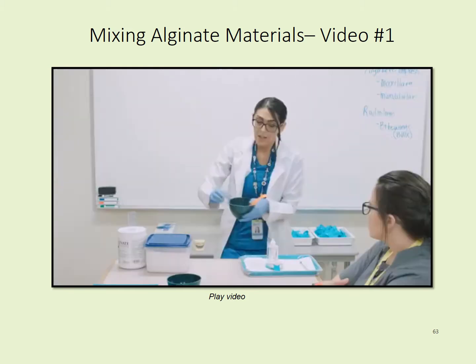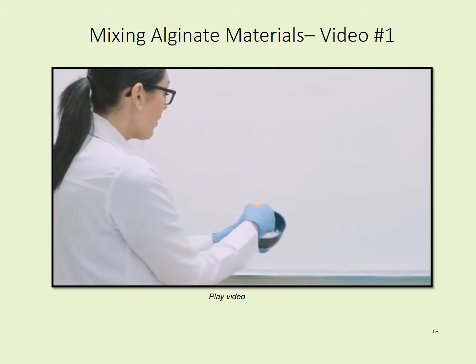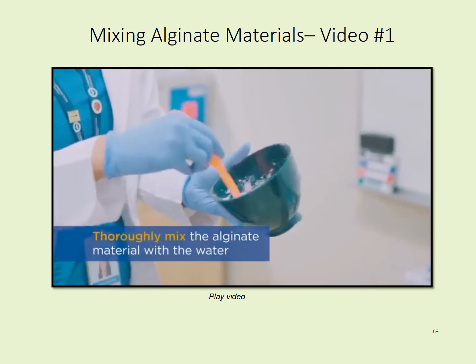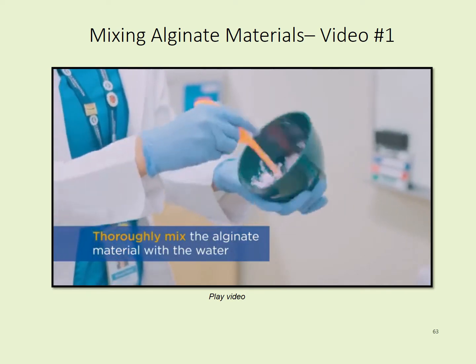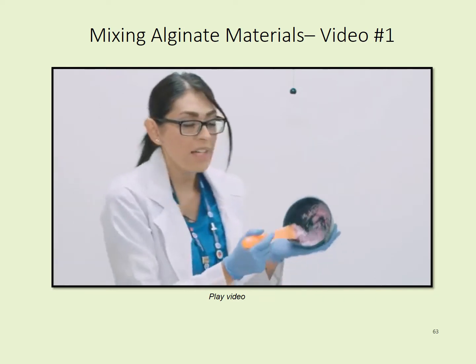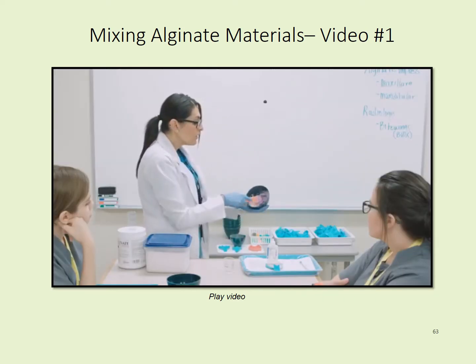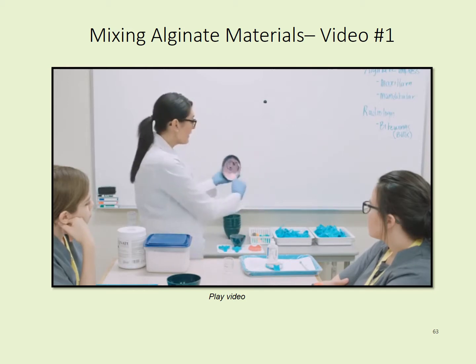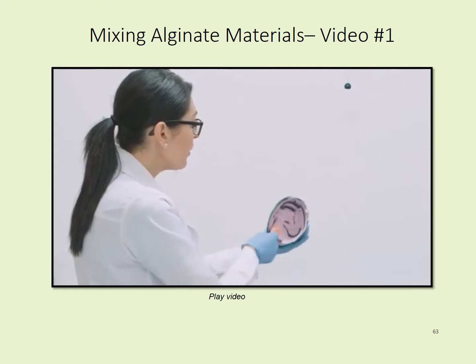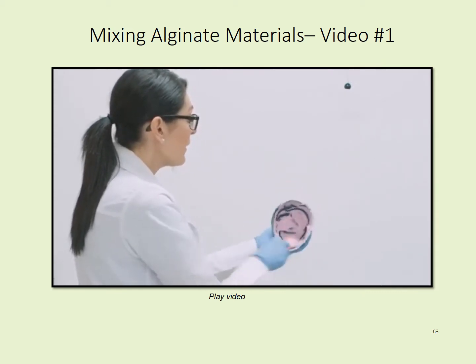All right. The first thing you want to do is mix the alginate impression material with the water, because if you start mixing like crazy, all the powder is going to pop out everywhere. So you want to go ahead and get everything wet. So now you guys can see all that clumpiness inside, right? Okay. So the next thing you want to do is press this material against the side of the bowl so all the bubbles and all the material can mix together. And again, this is a skill that we will be able to practice.